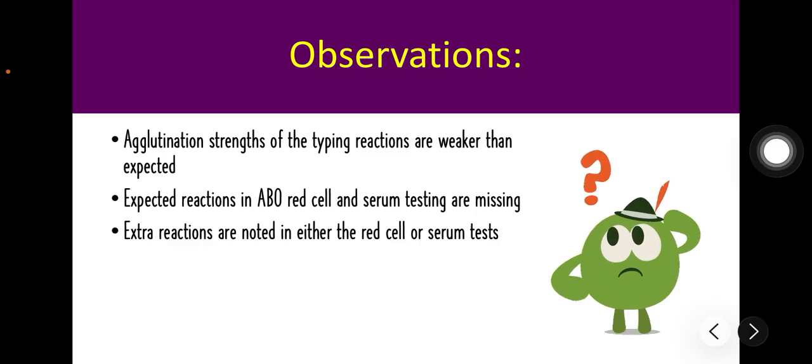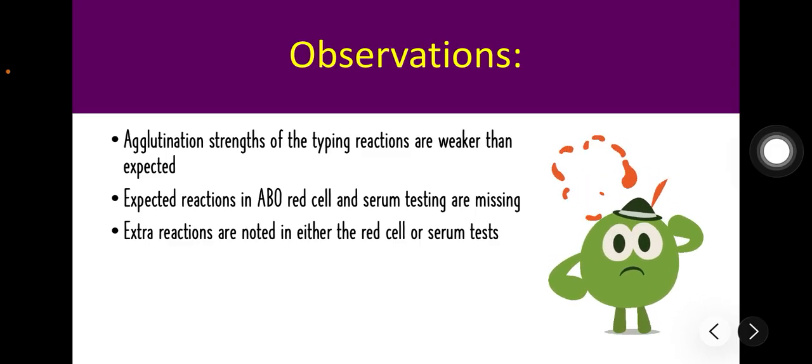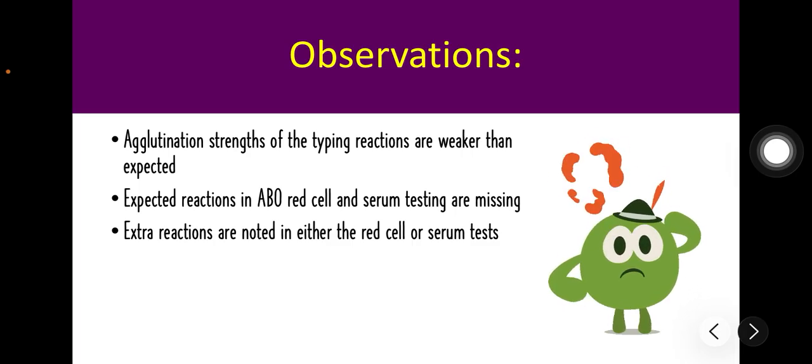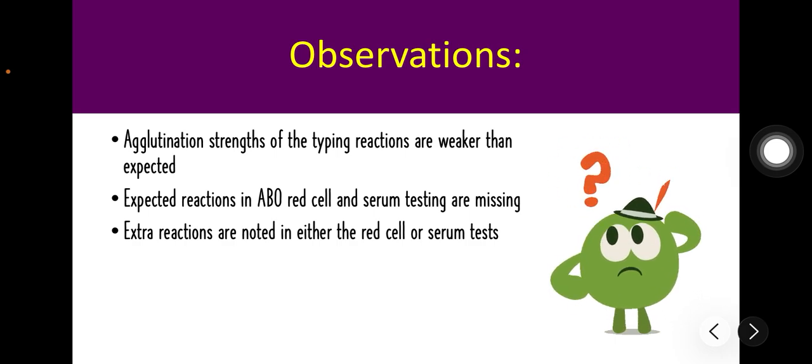This looks like agglutination, but it is actually a physical stickiness that can be dispersed by adding saline or performing a saline replacement technique. We also have subgroups with anti-A. An A2 or an A2B individual may produce a naturally occurring anti-A1 antibody, which will cause their serum to react with the reagent A1 cells used in the laboratory.